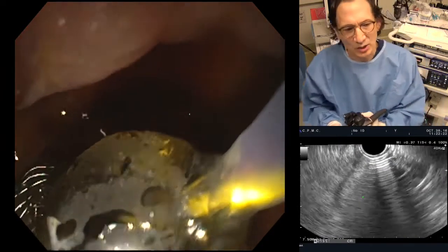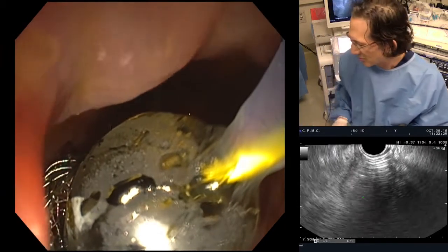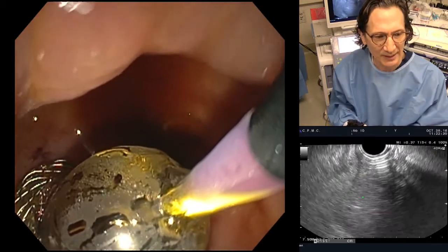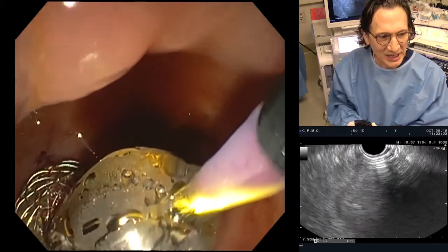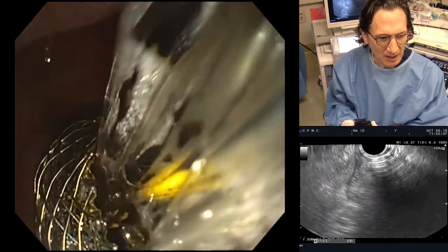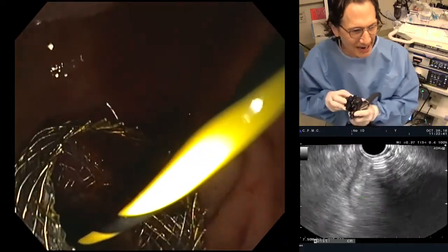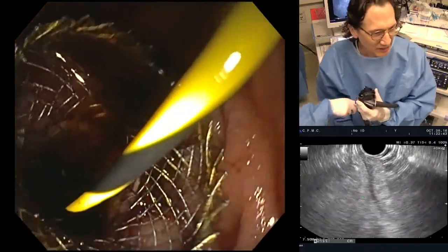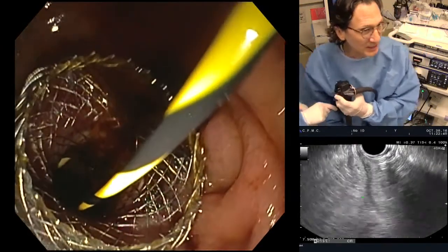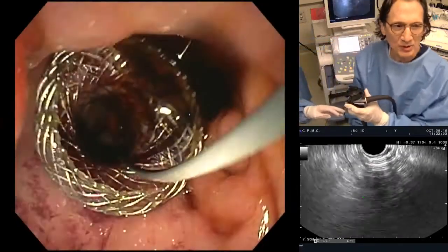All right, so we're at 12, and I think that's going to be enough. I'll go to 13.5. We'll meet halfway. We won't go to the 15, but we'll go to 13.5 and go down now. All right, so you're going to see there it's dilated. Now I'm going to switch out. You can even look in a little bit. See that? That's the inside of the gallbladder. And you see the cholecystostomy tube in there. See it?